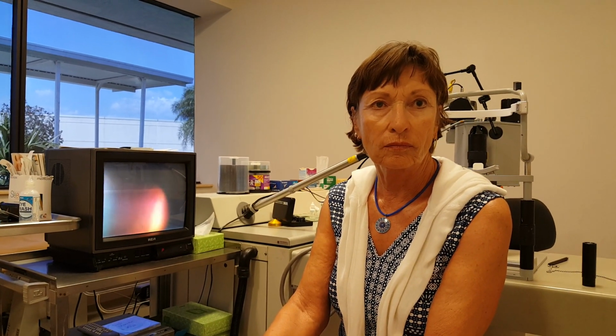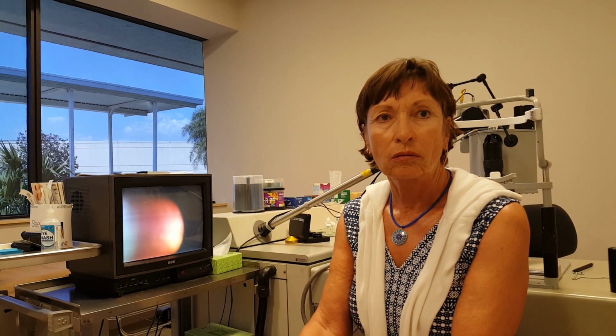Definitely, a lot of difference. A lot of ophthalmologists don't recognize the fact that sometimes when you have what we call thickened hyaloid, which is the surface of the vitreous gel, that can be a problem. Intermittently, your vision can be perfect, 20/20, but if that is in your field of vision, it can deteriorate tremendously. And so I took an approach of actually splitting the hyaloid, which is unusual in a case like this, but it worked. And you're a happy patient. That's all that counts, right?